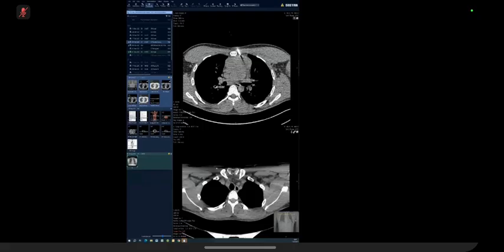So after the CT, you would say it doesn't communicate with the thyroid. So I am excluding thyroid and leaving me with lymphoma and thymic, etc. as the more plausible differential diagnosis the patient needs. Again, the report needs highlighting to the referrer on the X-ray. You need to do CT, you need to highlight to the MDT and for consideration of biopsy.